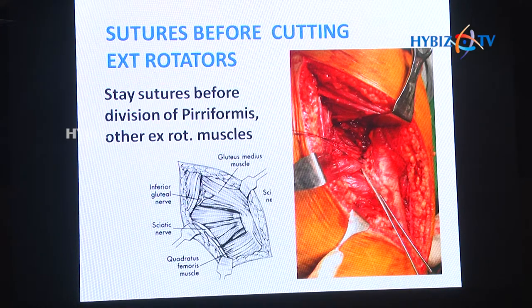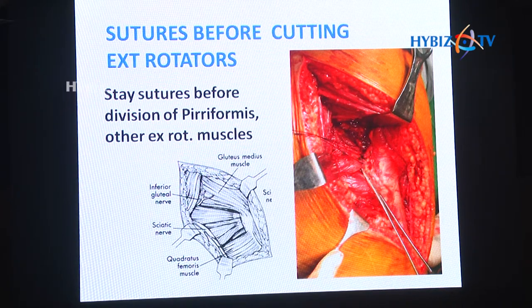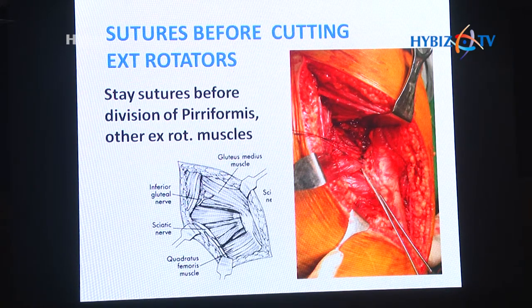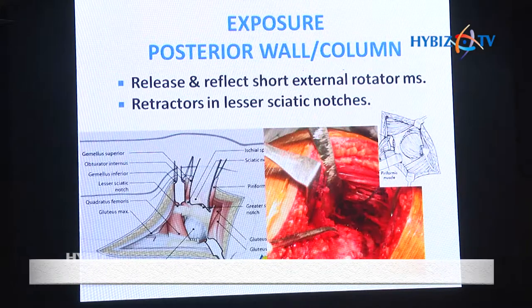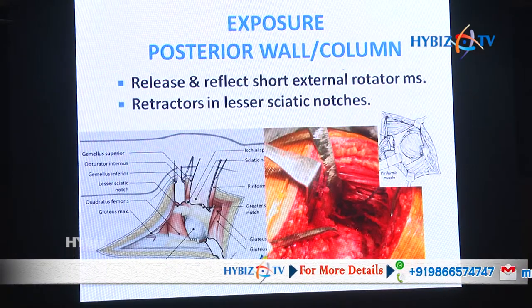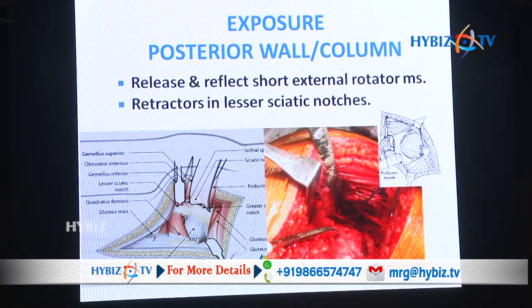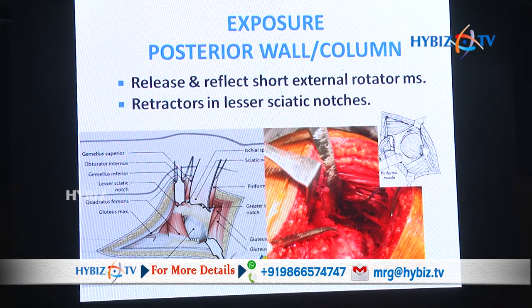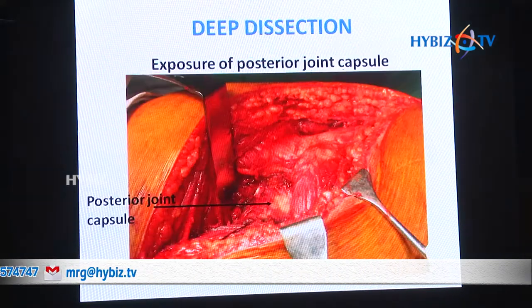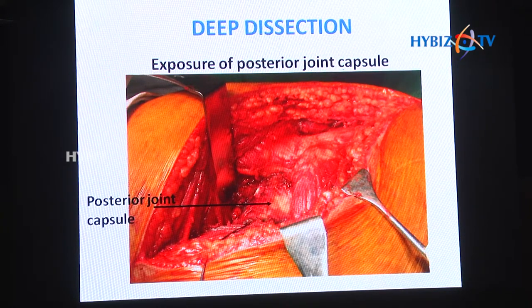You should identify the piriformis and other external rotators, go proximal approximately 1.5 centimeters away from the trochanter, and apply a stay suture before division, otherwise you will not be able to reattach the piriformis and you will damage the vessels. Then release these muscles, retract them, and put a retractor in the lesser sciatic notch — you should not put the retractor in the greater sciatic notch.